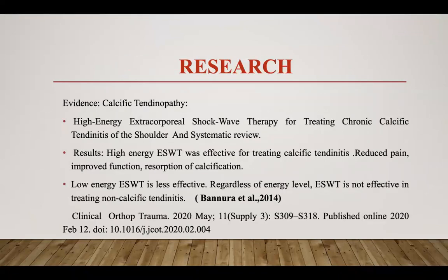The last research evidence is on calcific tendinopathy. High energy extracorporeal shockwave therapy for treating chronic calcific tendinitis of the shoulder, a systematic review. Result: high energy extracorporeal shockwave therapy was effective for treating calcific tendinitis, reducing pain, improving function, and resorption of calcifications.